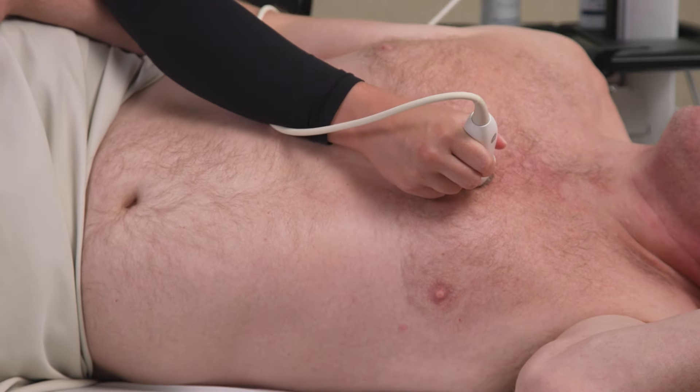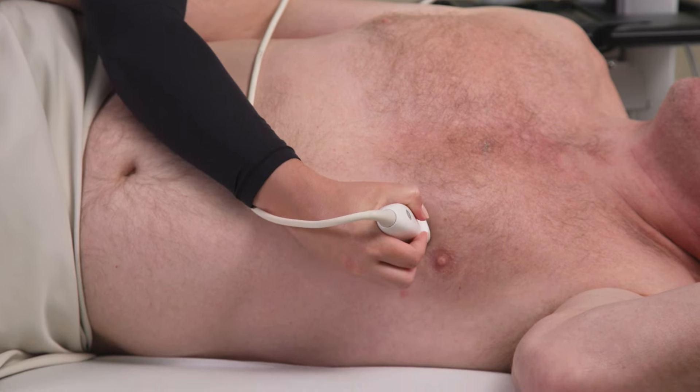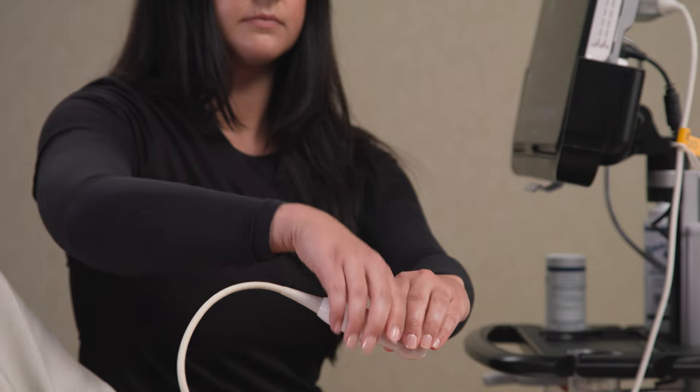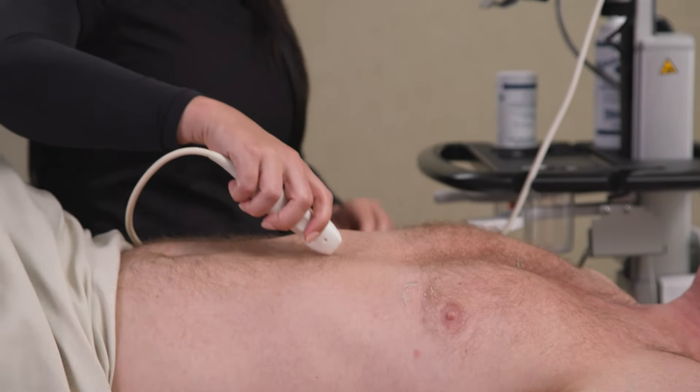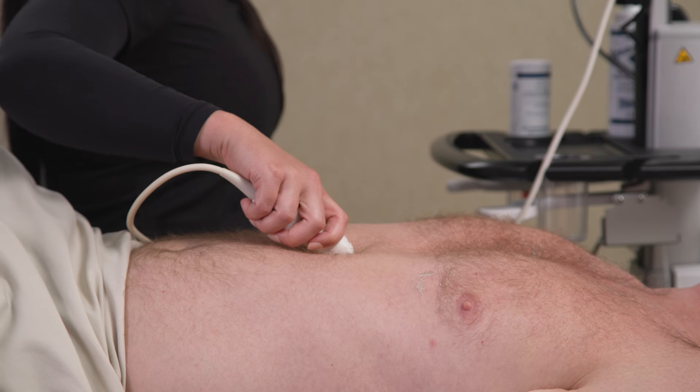For the apical window, keep holding the probe as you did for the previous view. For the subcostals, we use an overhand grip. Grip the probe close to the face with your thumb on one side and the rest of your fingers on the other, mimicking a scooping motion.